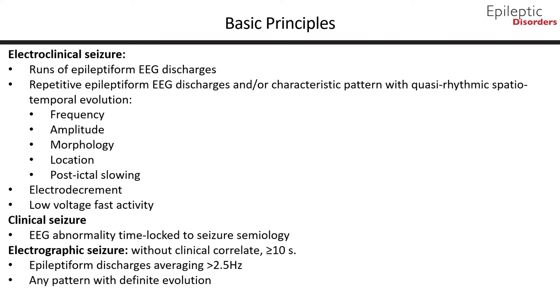An electroclinical seizure may also be associated with post-ictal slowing that could be either focal or generalized. Two other short-duration, less than 10 seconds, EEG seizure patterns are electrodecrement and low-voltage fast activity seen during clinically apparent epileptic seizures.